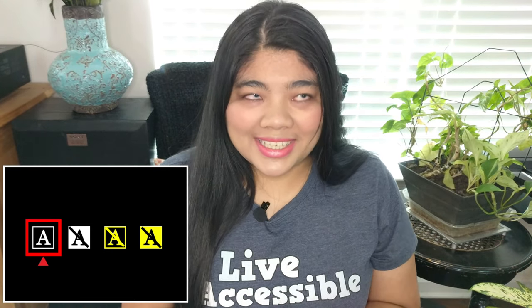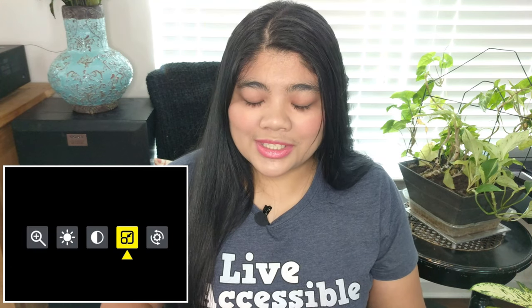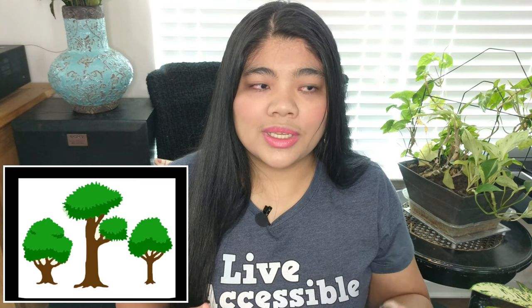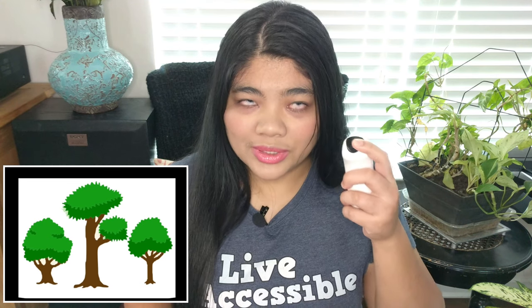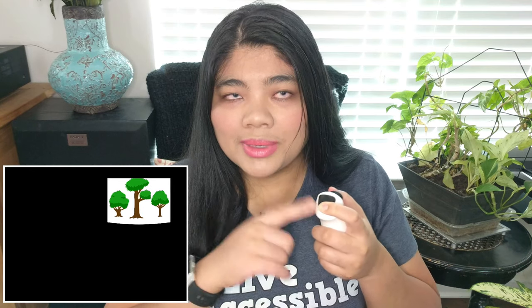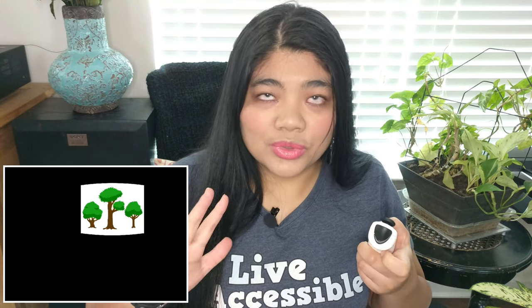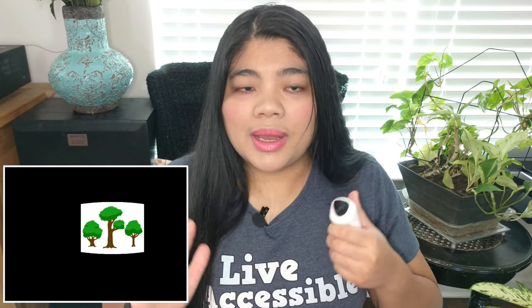The next one is a really interesting one because it allows you to change the size and position of the image. So if you go into that setting, what you want to do is press and hold that trigger button down and then move the joystick up and down to zoom in and zoom out of the image. And then from there, you can release the trigger button and then move with the joystick, and that way you can move the image to a certain spot on the screen.